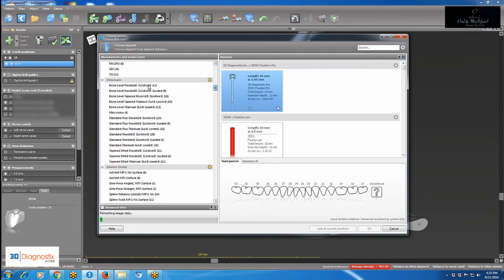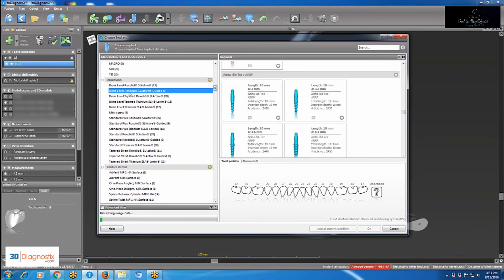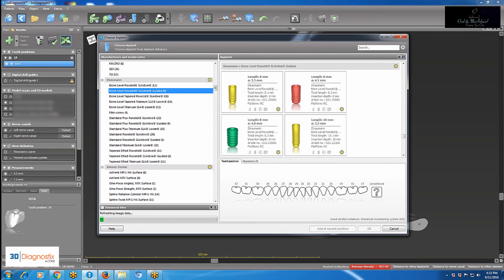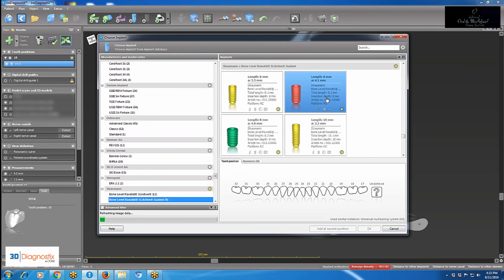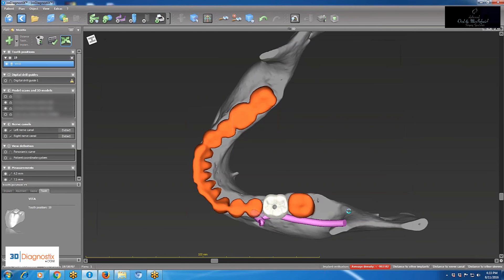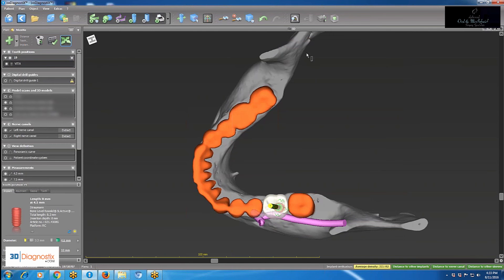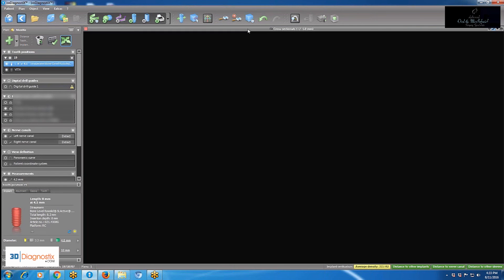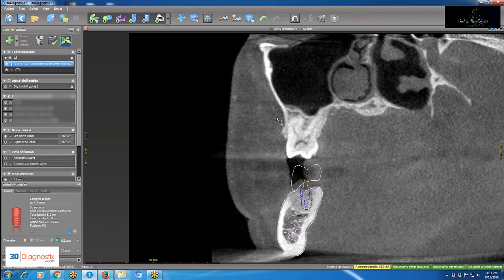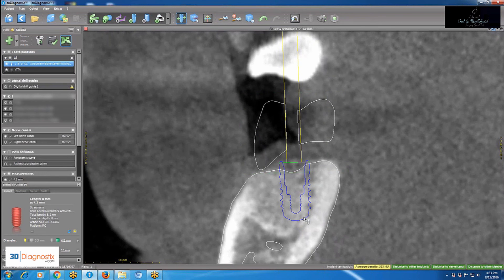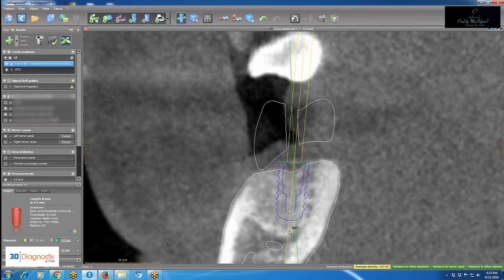Step two is to open the implant library. I choose Straumann for this case — Straumann bone level guided implants — and select the most suitable implant, in this case 4.1 by 8. Click OK and it is added perfectly below the virtual crown.